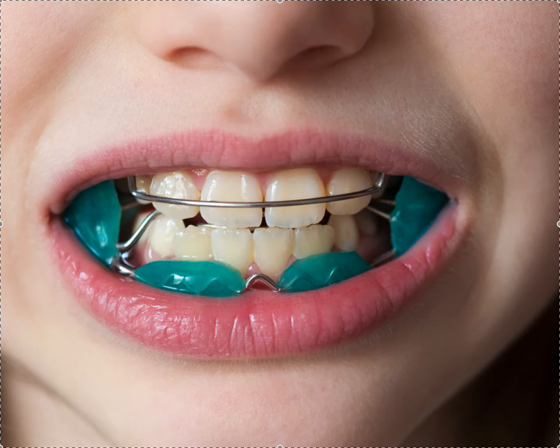Welcome to StraightSmileSolutions.com. Today we're talking about the Frankel appliance, which is one of many different mild functional appliances and orthotropic appliances out there. This has been around since the World War II era, but it's still a good appliance. I'll talk about the pros and cons — I think I've used it once. I wouldn't say it's my go-to appliance, nor do I recommend it, but it really does work.